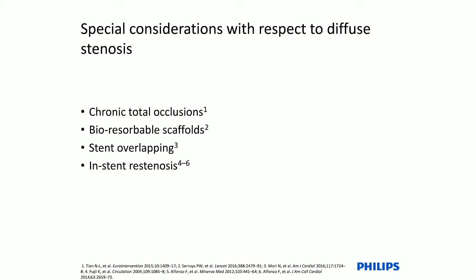One of the reasons was, with this information in hand from angiography, we should certainly refrain from doing any type of maneuver, understanding that once we restore antegrade flow, this vessel will probably remodel again to achieve bigger dimensions.